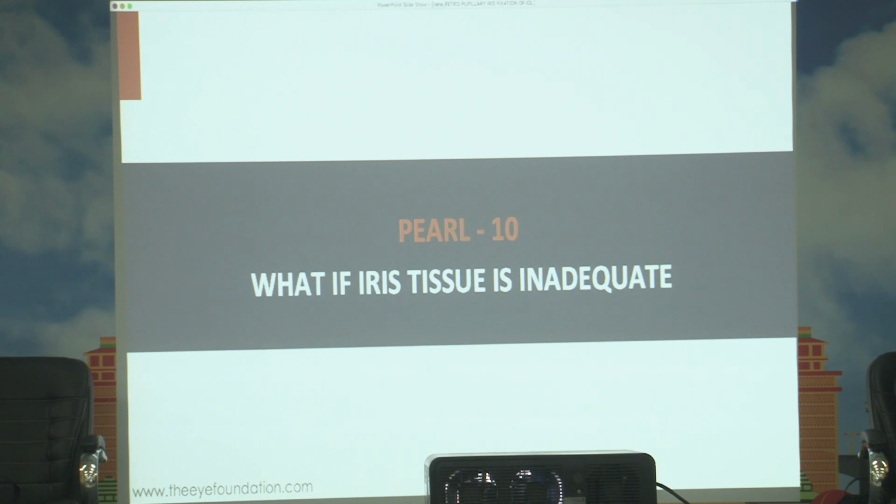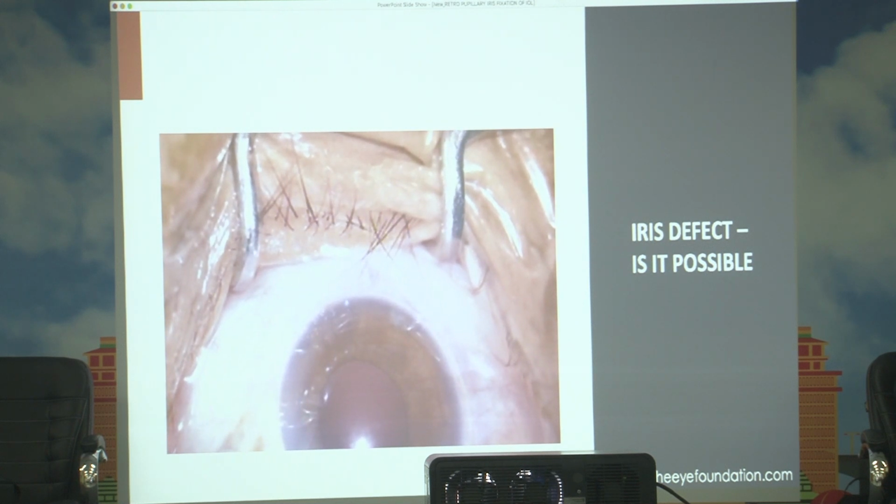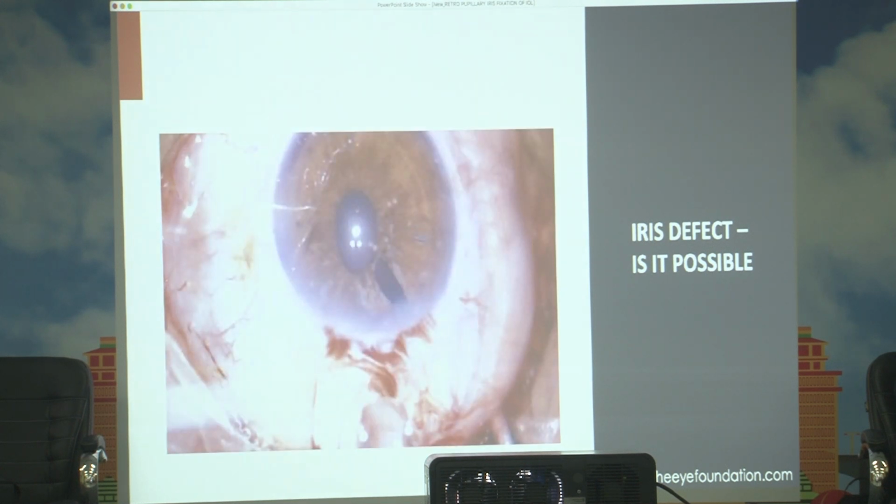Post-operatively, enough anti-inflammatory is needed. If the iris tissue is inadequate, as it was in this case, the primary surgeon had made a large tear. As you can see, it comes up.